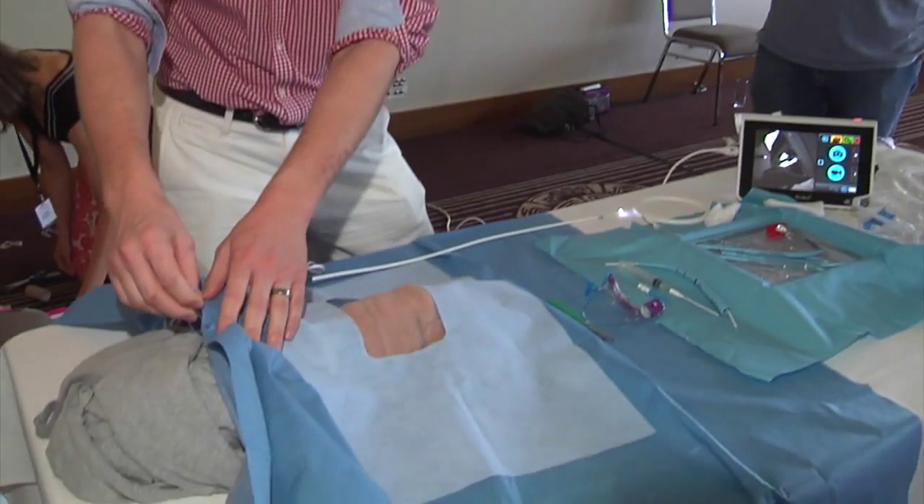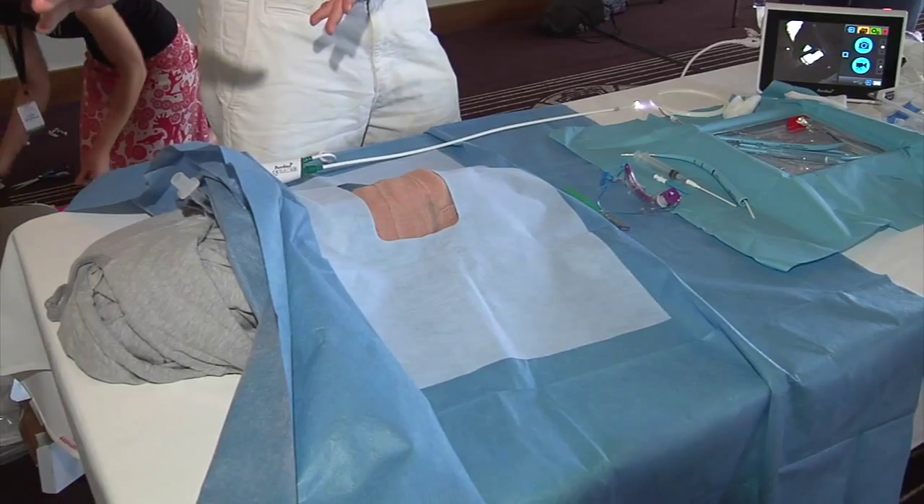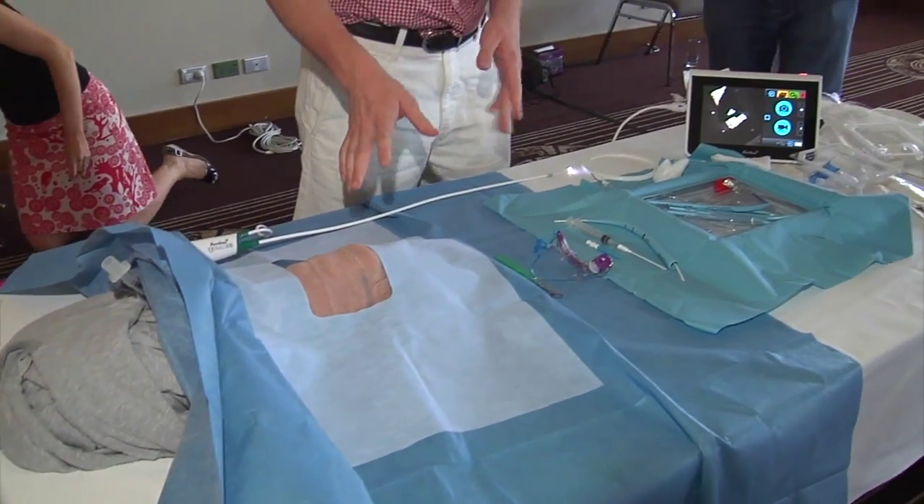The patient is anaesthetised and paralysed. This is the head of the patient here and they've got an ET tube in. We've pre-oxygenated and they've got end-tidal CO2 to confirm airway placement. You get all your kit ready, and we normally do it with three personnel: an operator doing the procedure, someone doing the airway, and someone doing the bronchoscopy.